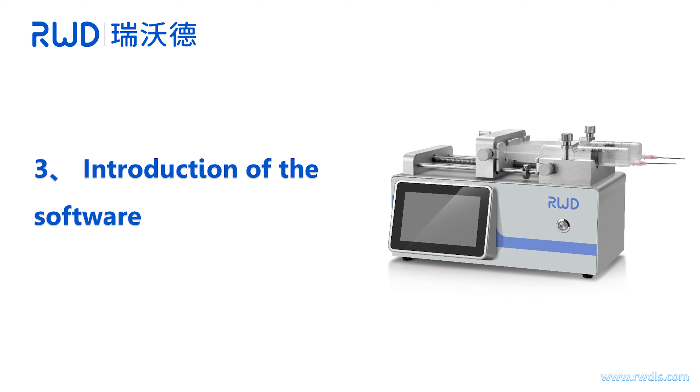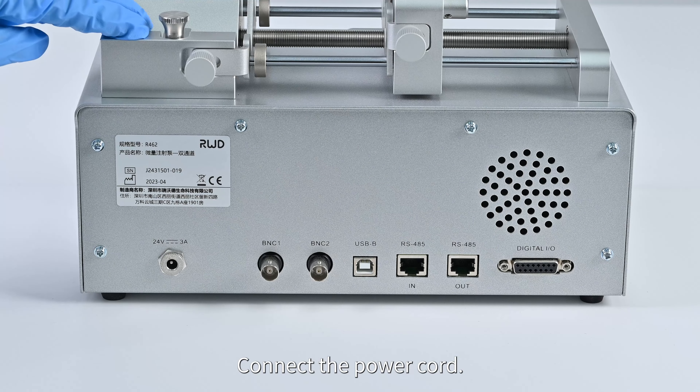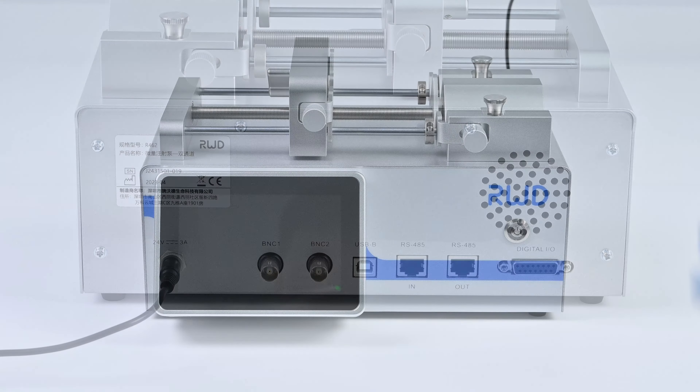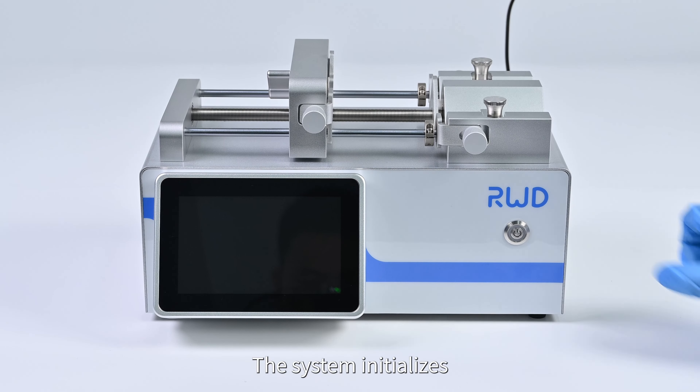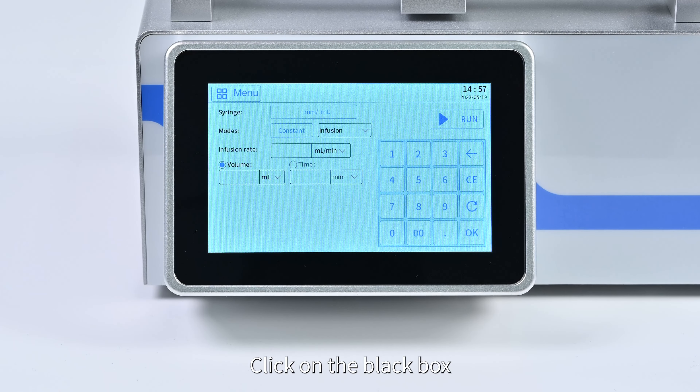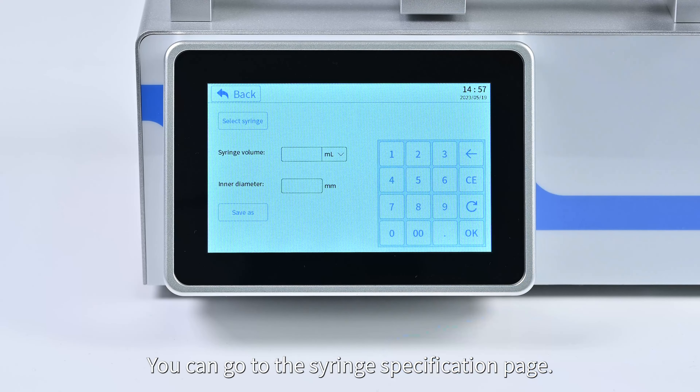Introduction of the software. Connect the power cord and press the power switch to start the device. The system initializes and then automatically enters the main interface. Click on the black box to go to the syringe specifications page.